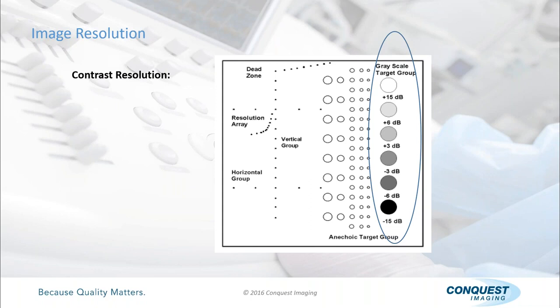Clearly, if they come back later on and say, what's the contrast? My contrast resolution's messed up, and you go and check it, then you won't know what it looked like 3 months ago, so you won't know if it's gotten better or worse or changed, right? Another question I have about axial and lateral resolution versus contrast resolution. What probes do you need to use to check axial and lateral resolution?